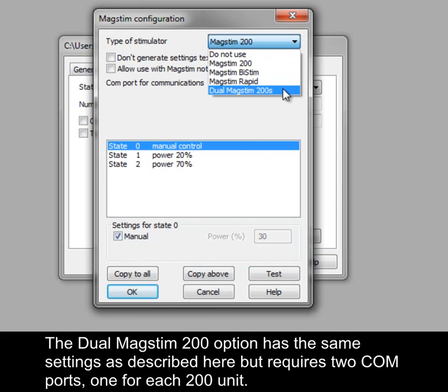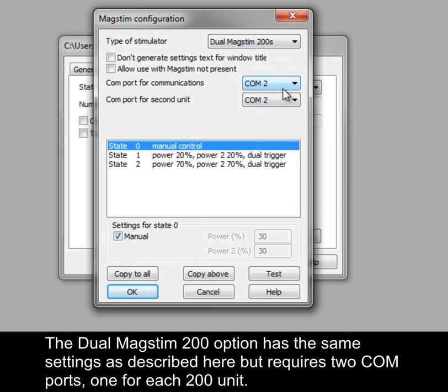The Dual MagStim 200 option has the same settings as described here, but requires two COM ports, one for each 200 unit.